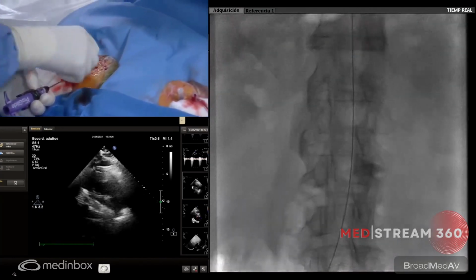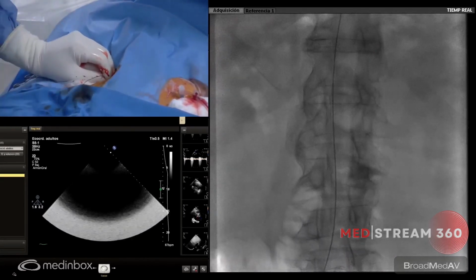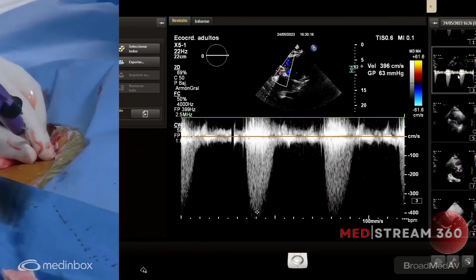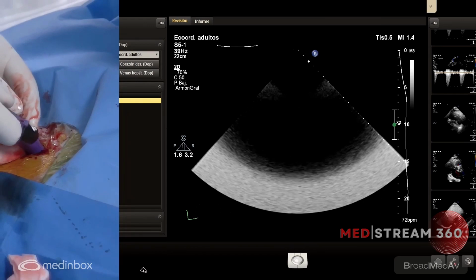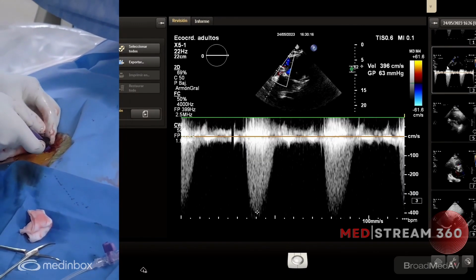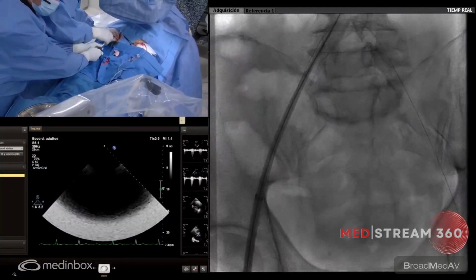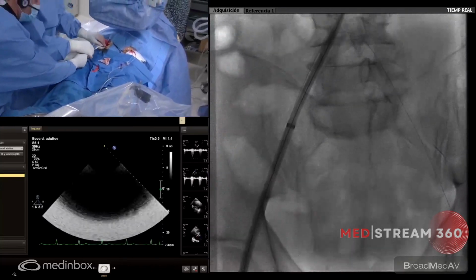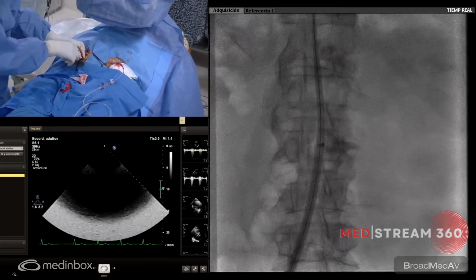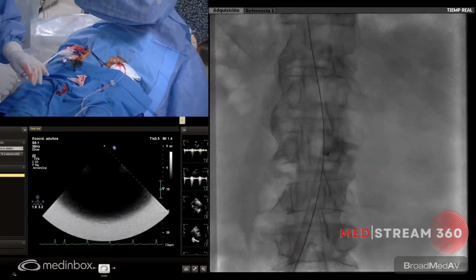Dr. Mukarsel, how is the ventricular function in this patient? And is the gradient the same as we had before? We have 64 of peak gradient here, about 4 meters per second velocity. Okay. So Carlos is attaching the introducer with the sheath because they are not fixed, and sometimes you can damage the artery if you lose the position.